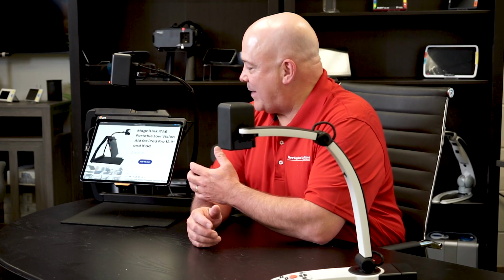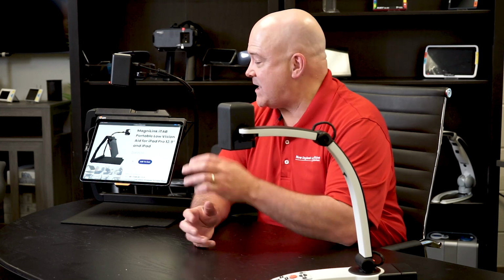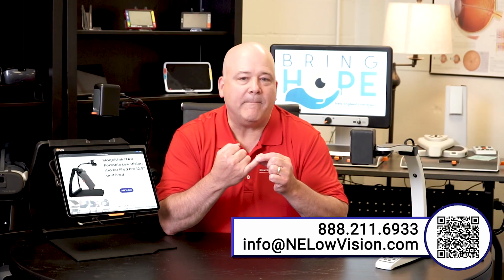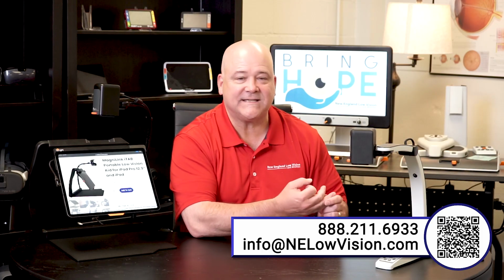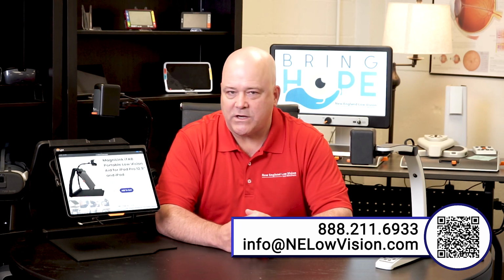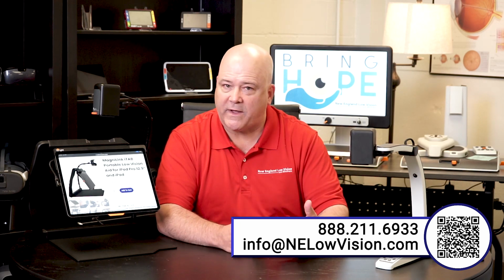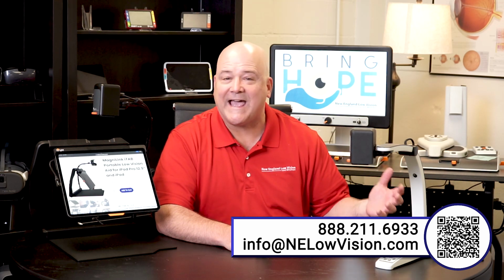Hi, welcome back. As we begin to get into the iTab, I want to let you know that the iTab joins a family of MagniLink technologies that already exist, and it complements the MagniLink Tab and the MagniLink S. And we're going to link to the MagniLink Tab in the notes below. We already did a video on that, and we also already did a video on the MagniLink S.